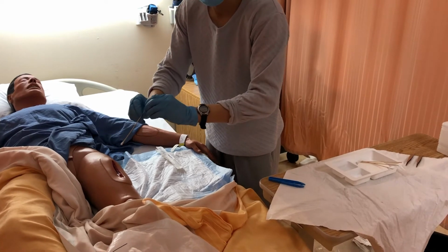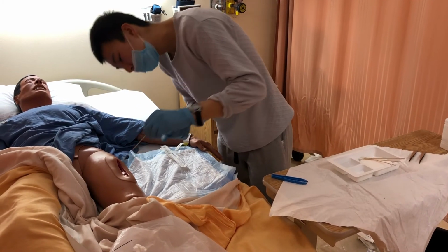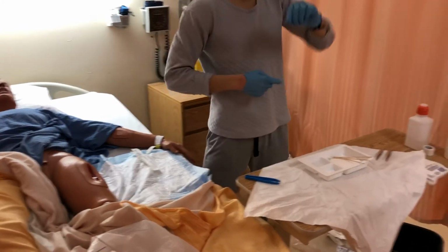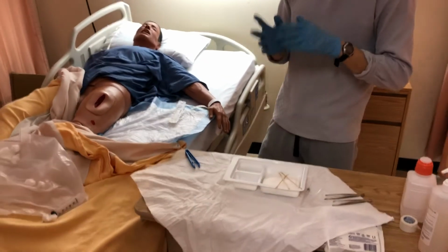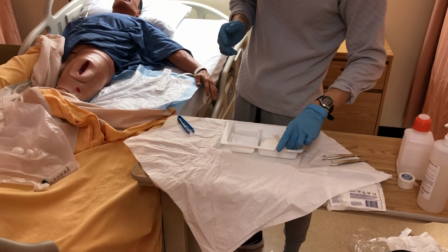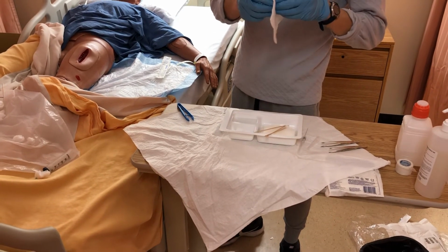There's also no undermining, and it has a depth of 1 centimeter. Okay. Now I've assessed the dimensions and all the assessments of the wound, and I've dried the peri-wound skin. Now I'm going to pack the wound, and in order to pack the wound, I'm going to first need a 4x4, and I'm going to saturate it in normal saline.